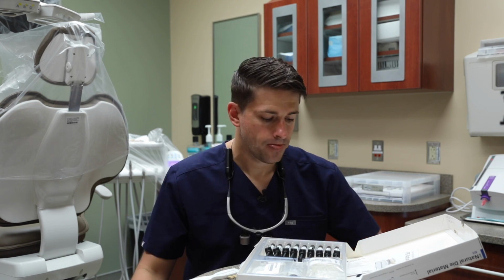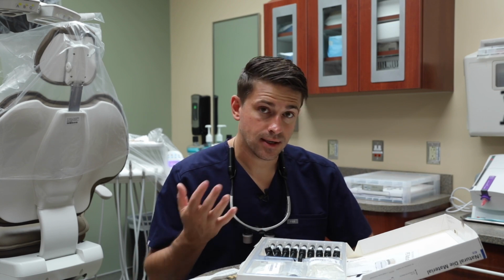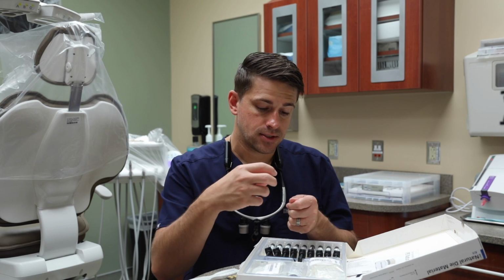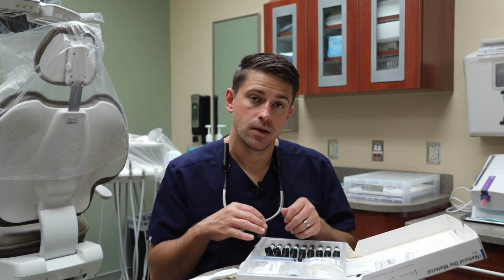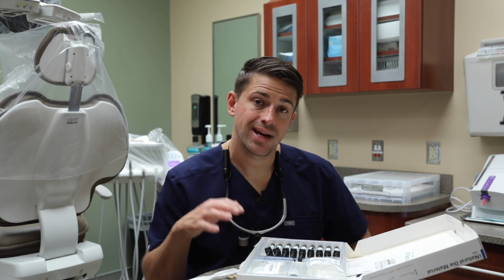shades onto. So what I'm going to do for applying the glaze is I'm just going to go ahead and create a custom die using one of these shades here that we can put inside the crown, and we can hold this, basically put the crown on this and hold this specific die here to allow us to apply the glaze to the crown without touching it or worry about messing up the glaze we're putting on. So that's going to be the next step, is creating a custom die for the crown.